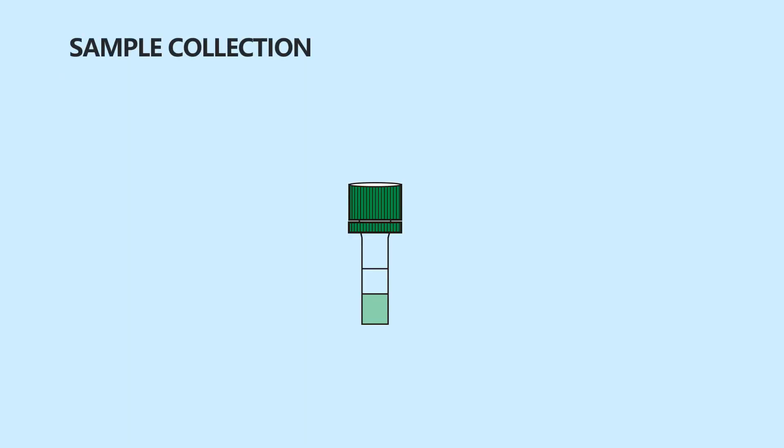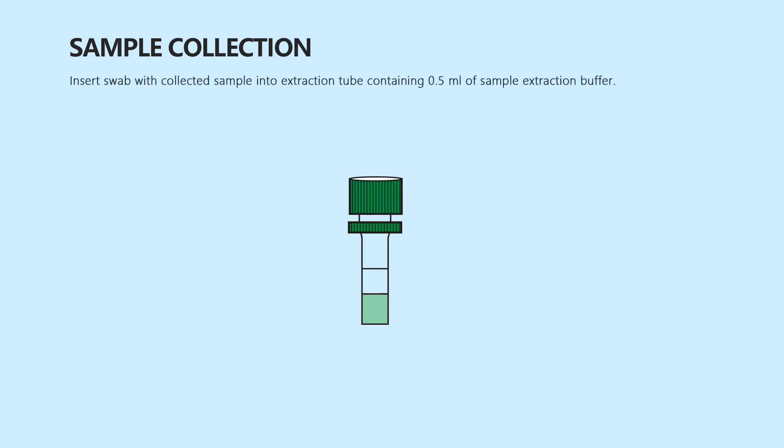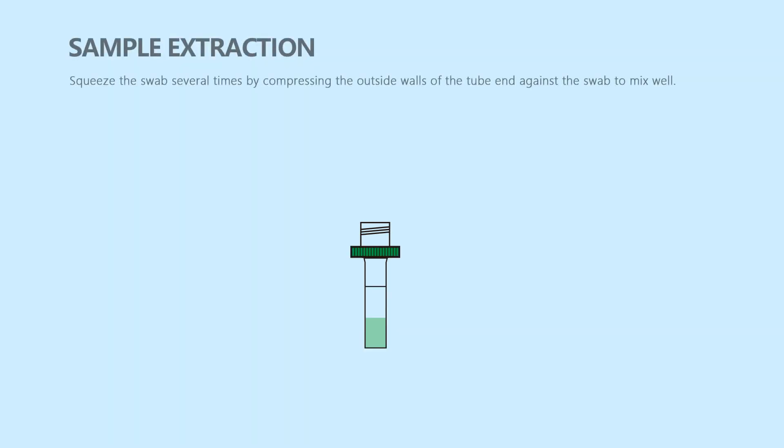Open the lid. Insert the swab with collected sample into the extraction tube containing 0.5 ml of sample extraction buffer. Squeeze the swab several times by compressing the outside walls of the tube against the swab to mix well.